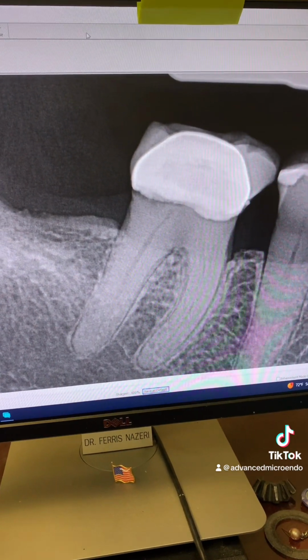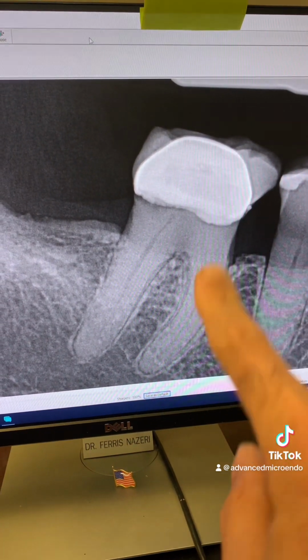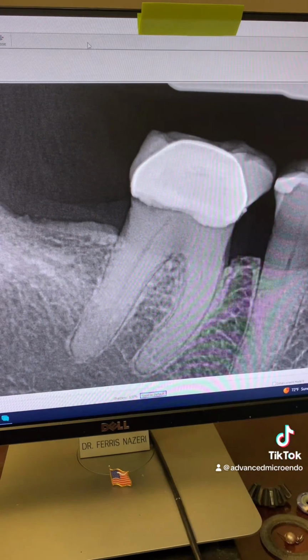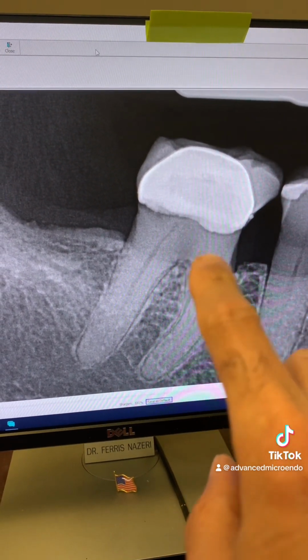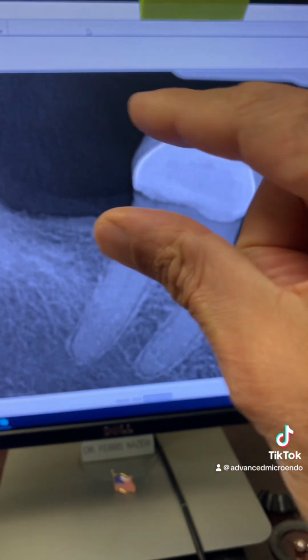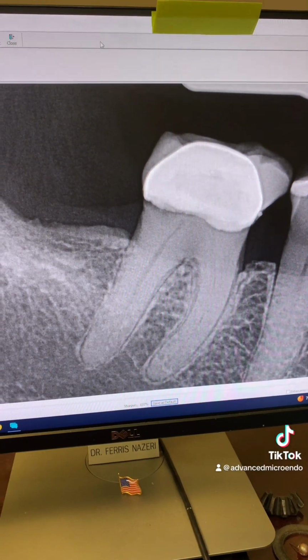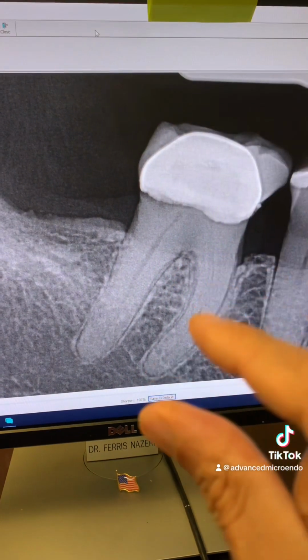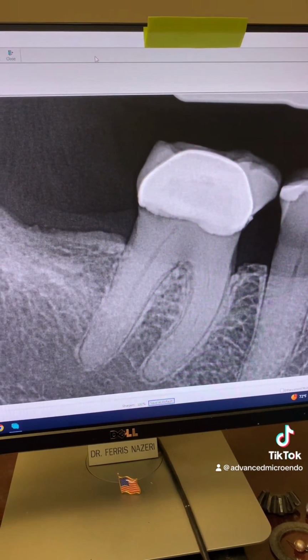Ultrasonic shaving of the mesial area to hit the canals, the mesial canals. This all I found almost immediately. So this patient could open this much. I swear, we could not fit a small child-sized bite block in her mouth. She was 81 years old, as I said.